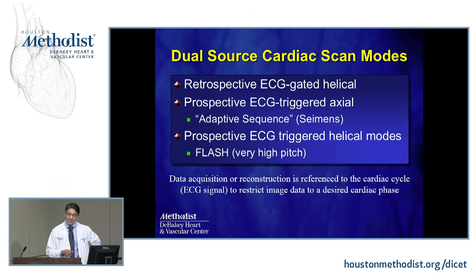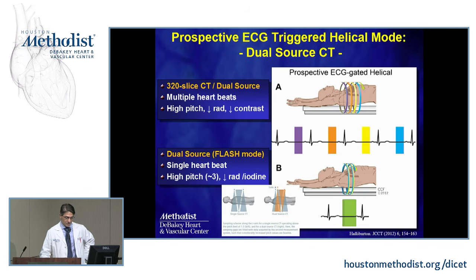And then finally, because the table is able to move so fast, we have a very high pitch. The table moves very, very fast. The scanner has a temporal resolution sufficient to also, in the ideal patient, be able to take a picture in one heartbeat. We call that our flash mode. And we'll talk about that. And that's actually helical acquisition.